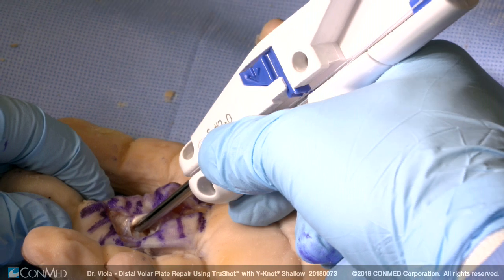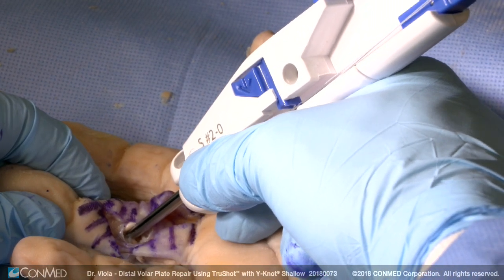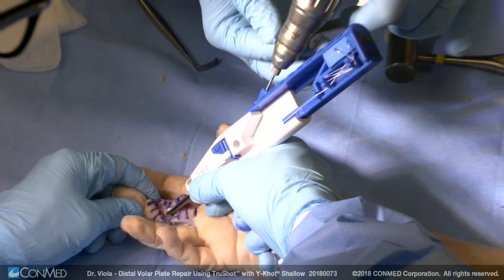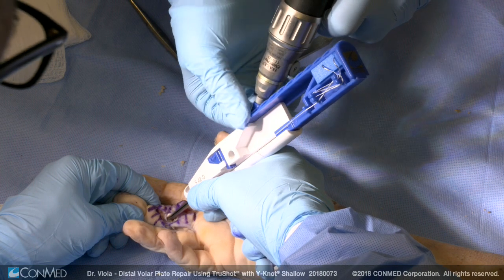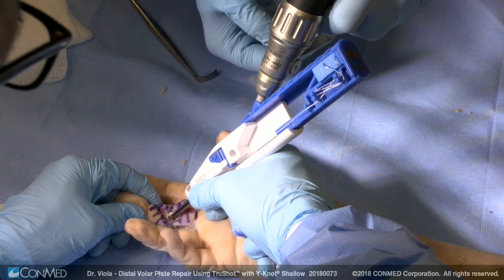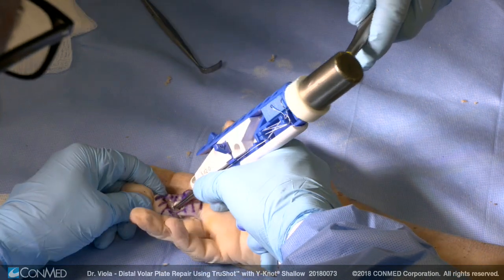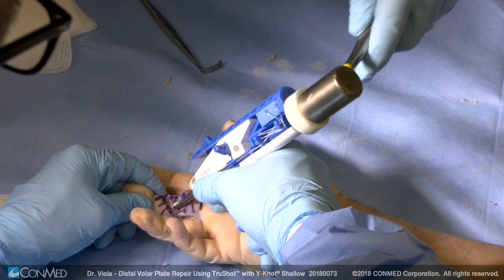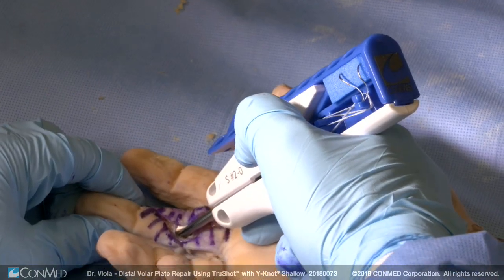So we use the TrueShot — why not. We seat the device with the serrated edge on the proximal aspect of the base of the middle phalanx. The serrated edge locks it in place. The 1.7 drill passes 10 millimeters into bone. The device is tapped in until the blue portion of the frame lines up with the white portion of the frame. We deploy the trigger to deploy the device.